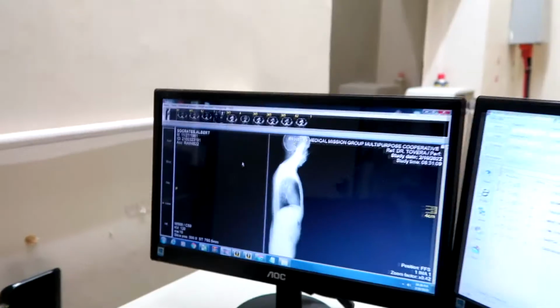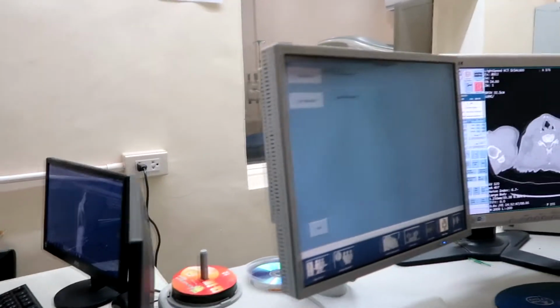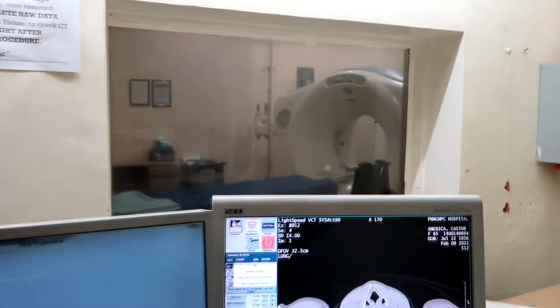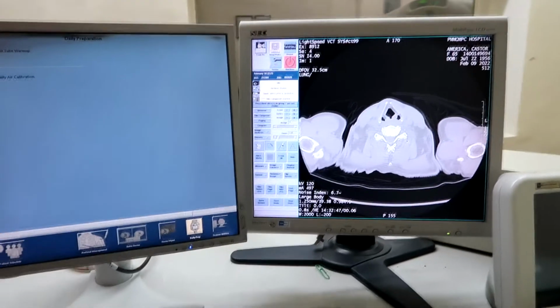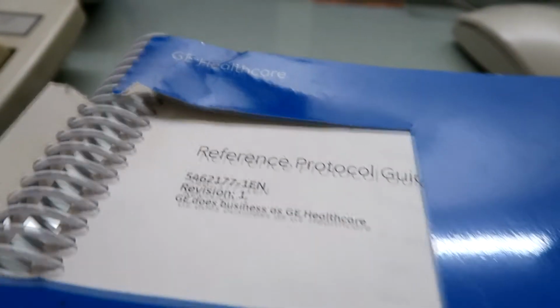Standard operating procedure for CT scan examination are as follows. The patient should be well informed in due time for him to arrange his schedule for the procedure. Preliminary preparation must be well instructed to ensure better visualization of intra-abdominal structures.